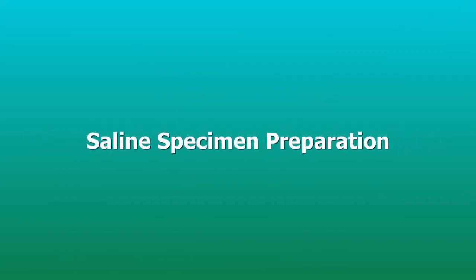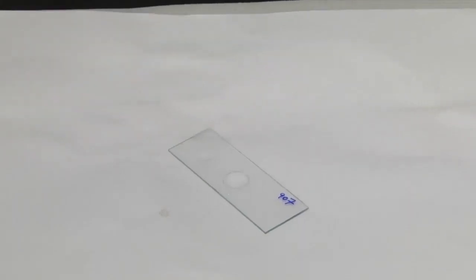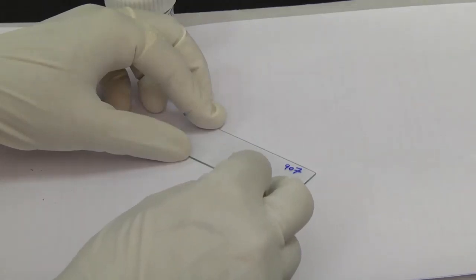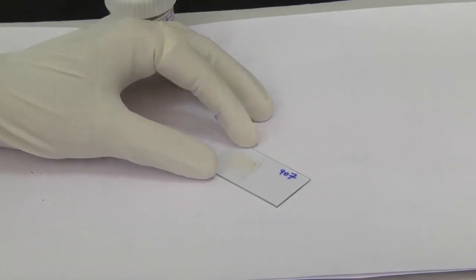Saline specimen preparation. Place a drop of normal saline on a labeled glass slide. Using an applicator stick, transfer a small portion of the stool from the mucoid or blood or particulate matter in a watery stool and mix well in the saline. Place a cover slip over it without any air bubbles and examine immediately.